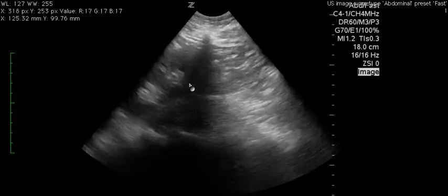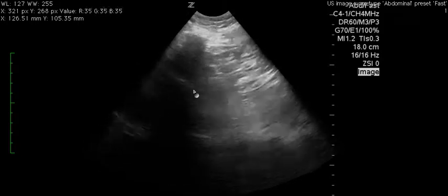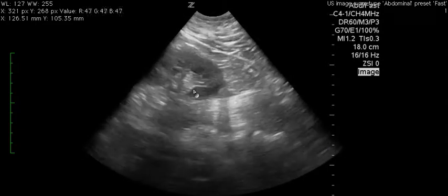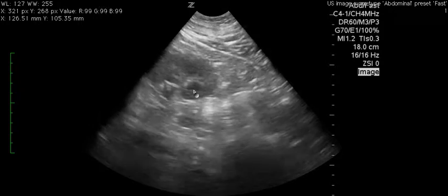Another view that was obtained was this one here. I think you're too far caudal, towards the feet, and so the left side is more tricky because there's a stomach, and it's actually higher up than you would expect — more towards the head. So next time I'd recommend moving the probe more towards the head to try to get the spleen in view.